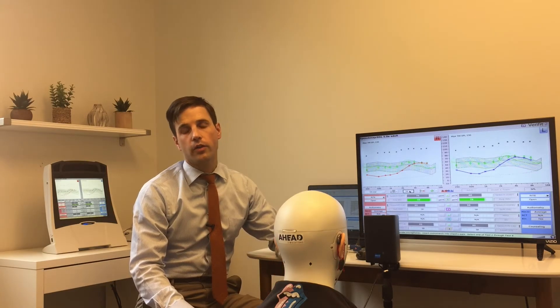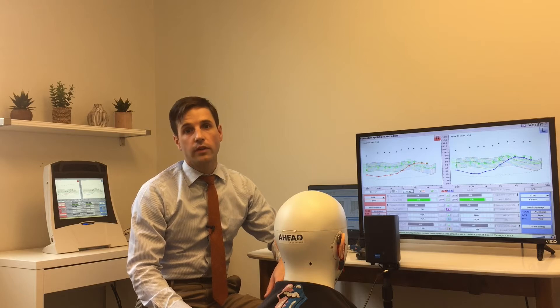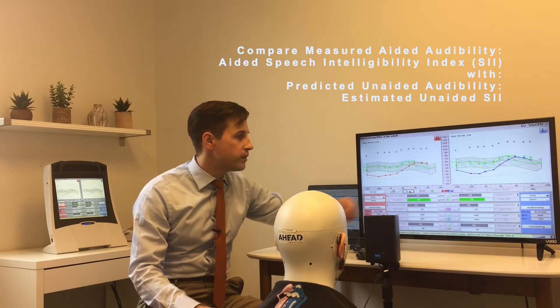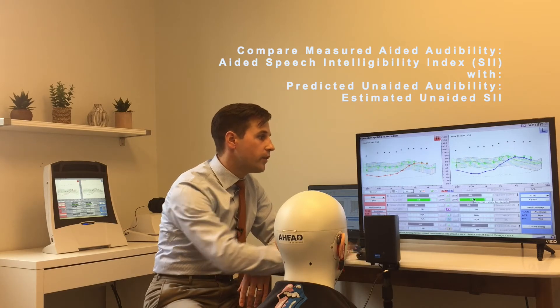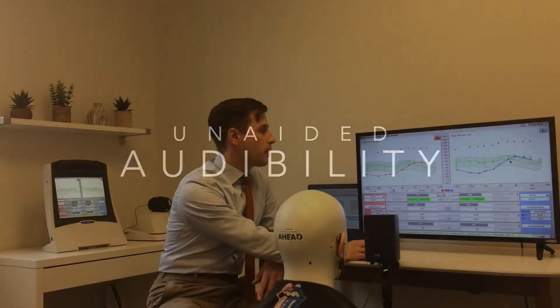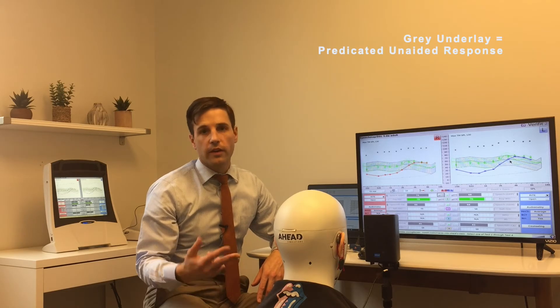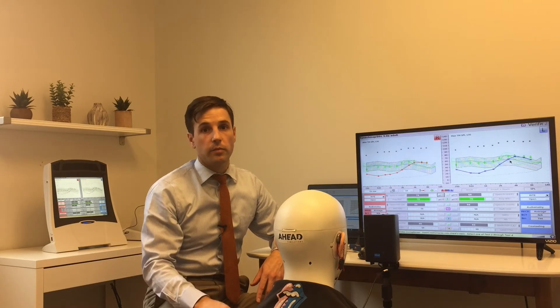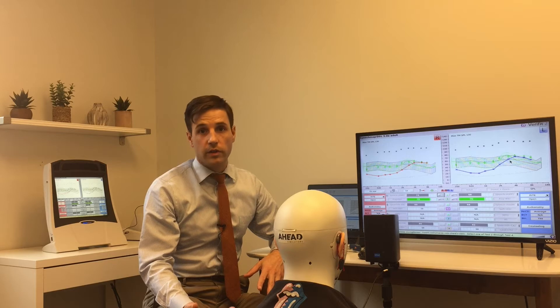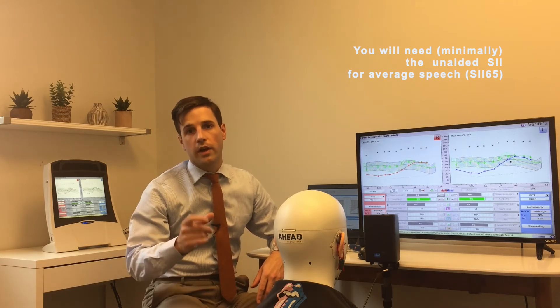When we ran the aided curve for average speech using the DSL algorithm in the manufacturer software, there's actually a surprisingly low improvement in aided audibility. If we look at the unaided SII estimate it's 74; the aided is 78 — so only four points on one side and about eight points on the other. That's telling us the hearing aids are helping, but only a little bit. One really nice thing about the Verifit is that it gives you an average unaided curve for each level of speech, allowing you to look at the difference between unaided and aided. If you're using a less expensive computer-based system, I'd encourage you to run a quick unaided curve at 65 dB so you have that unaided SII number.